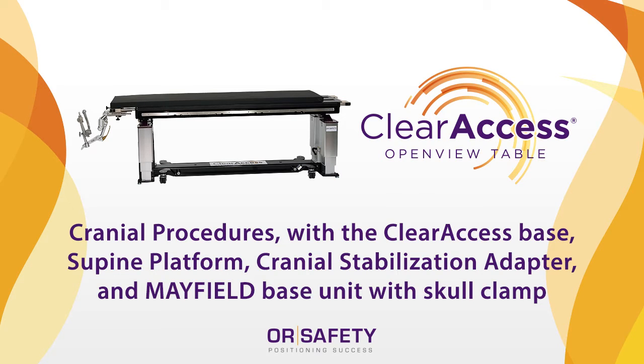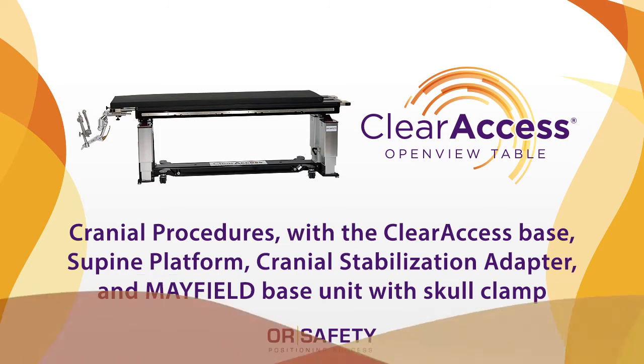This video includes an overview of the entire neurocervical package and detailed setup instructions for the Clear Access Table Base, supine platform and pad (flat top), and cranial stabilization adapter with non-OR safety equipment, the Mayfield base unit and skull clamp. This setup is typically used for cranial procedures that require cranial stabilization, such as brain surgery.